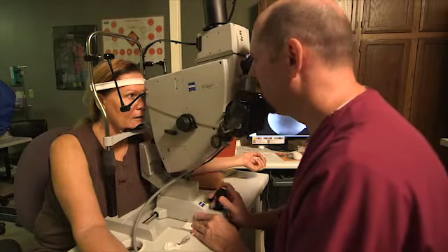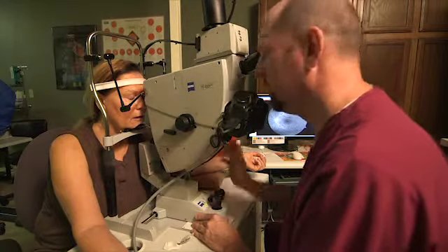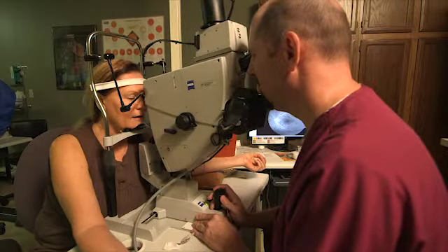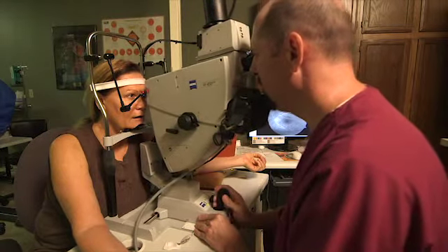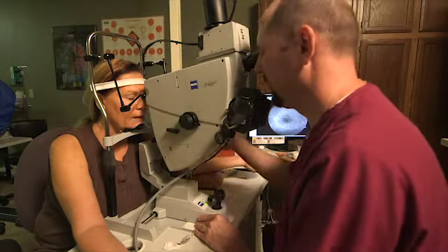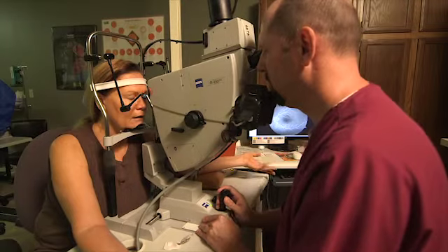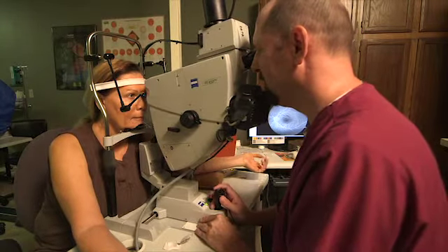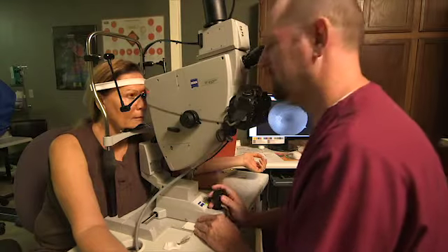And contrary to what you may think, there are no X-rays in this test. Abnormal vessels typically leak as the study progresses. Most angiogram cameras are now digital, so processing film isn't required. Your retinal physician can review your scan immediately to diagnose and make treatment recommendations.